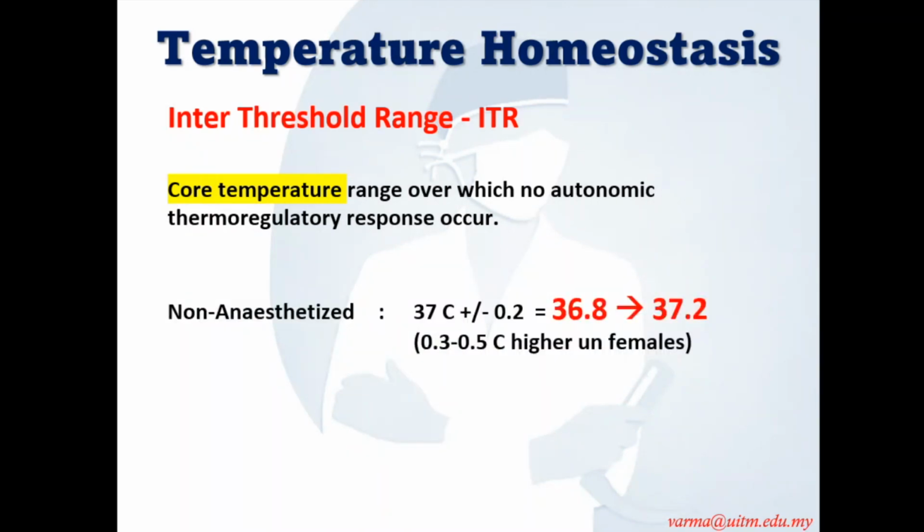This differs in an anesthetized versus a non-anesthetized patient. In a non-anesthetized patient, the gap is shorter. It means the patient's thermoregulatory mechanism is good.